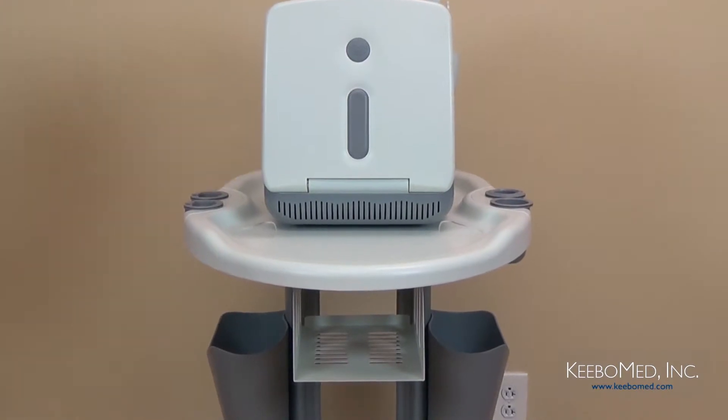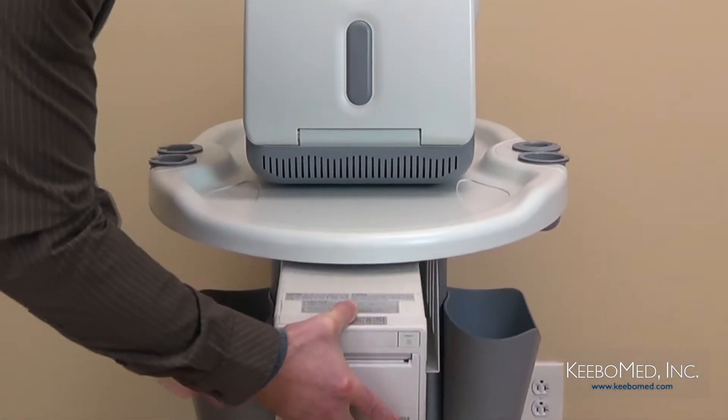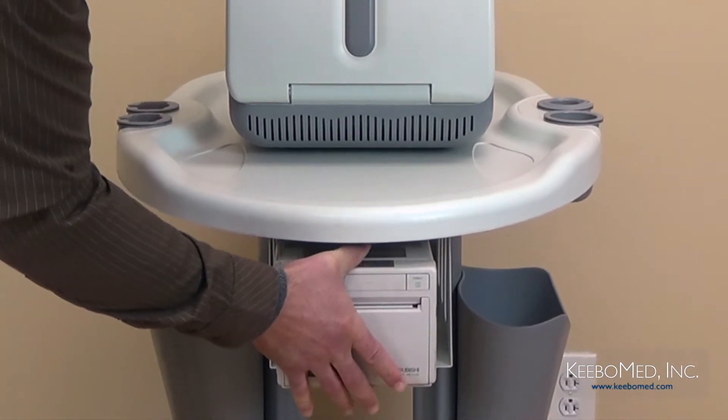Step number one: put the video printer beside the main unit, or on the video printer shelf if you are using a trolley.